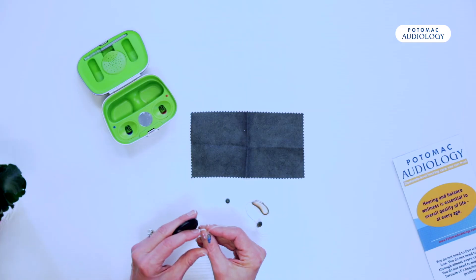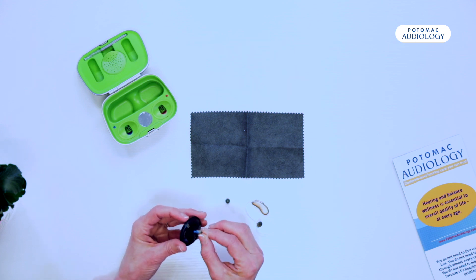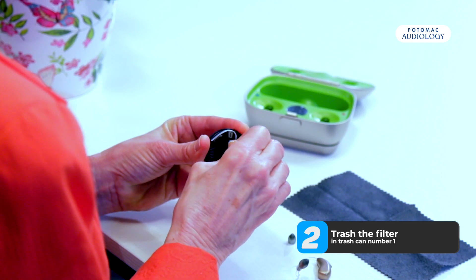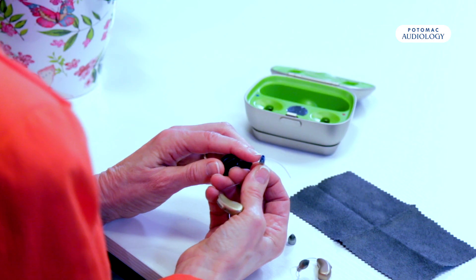So if we take the tip of your receiver where you see the white filter and put it into the little opening next to number one — the trash can — you'll hear a little pop and it's taken the old filter out. If you look on the tip you'll see that it's not white anymore.